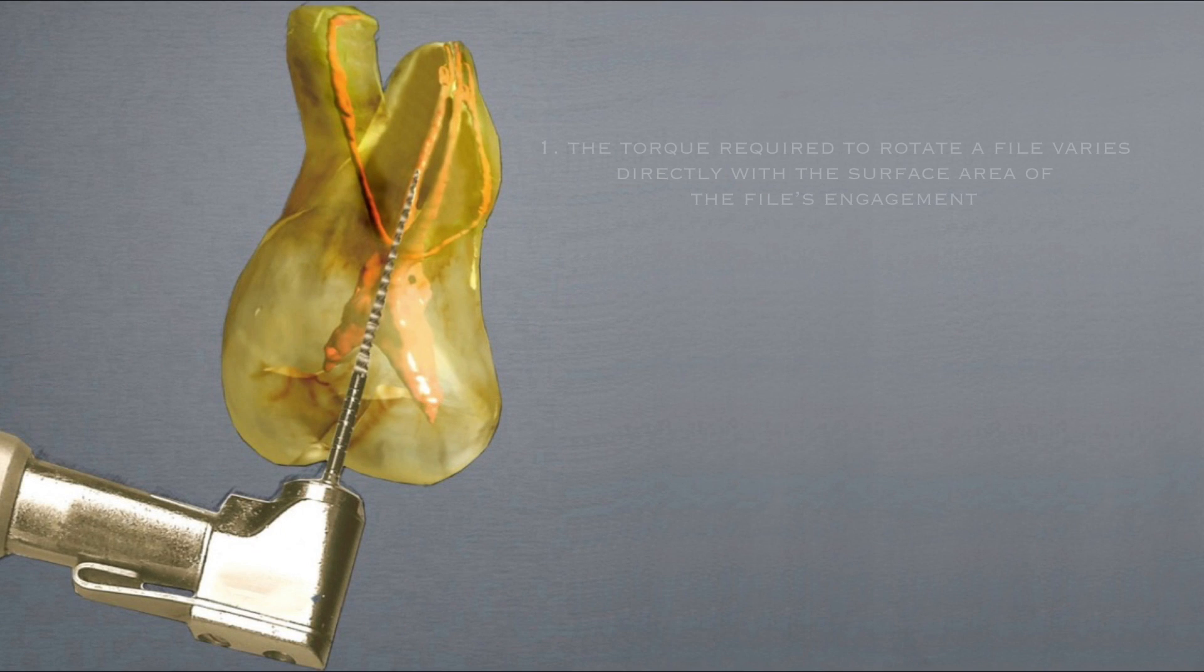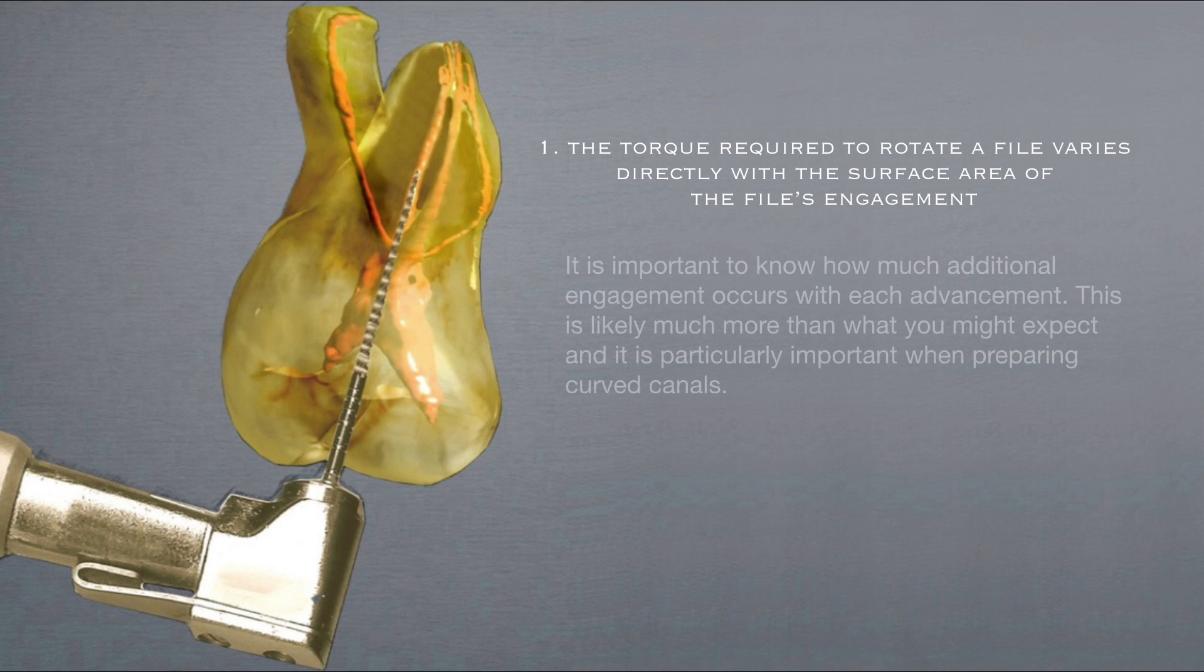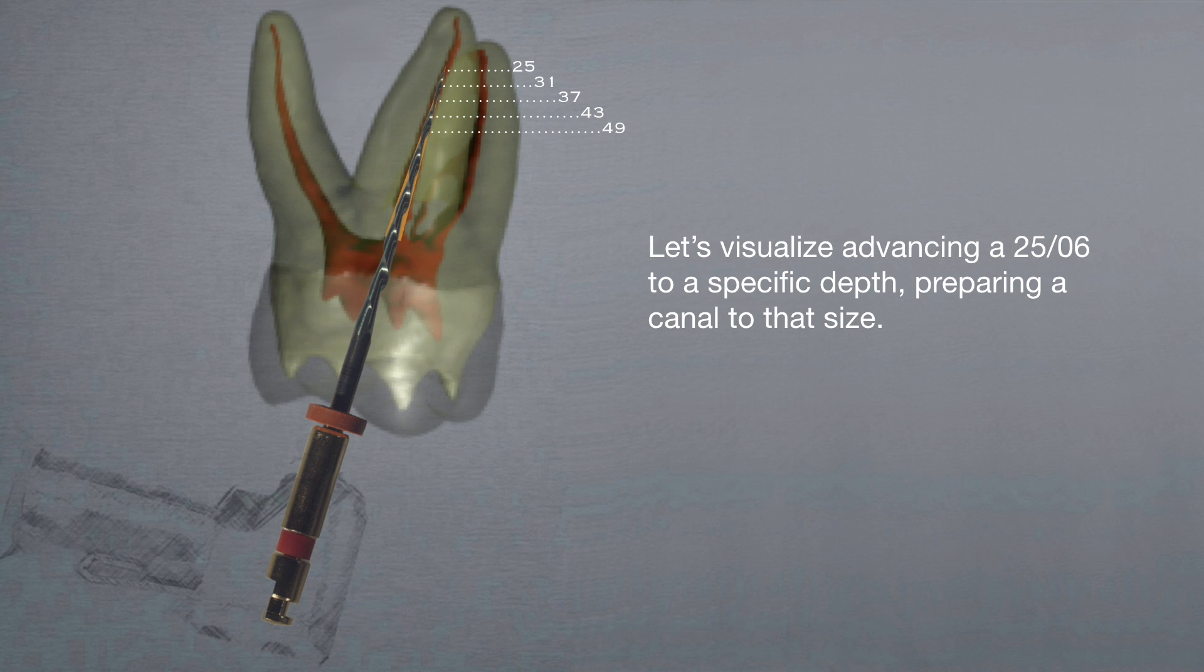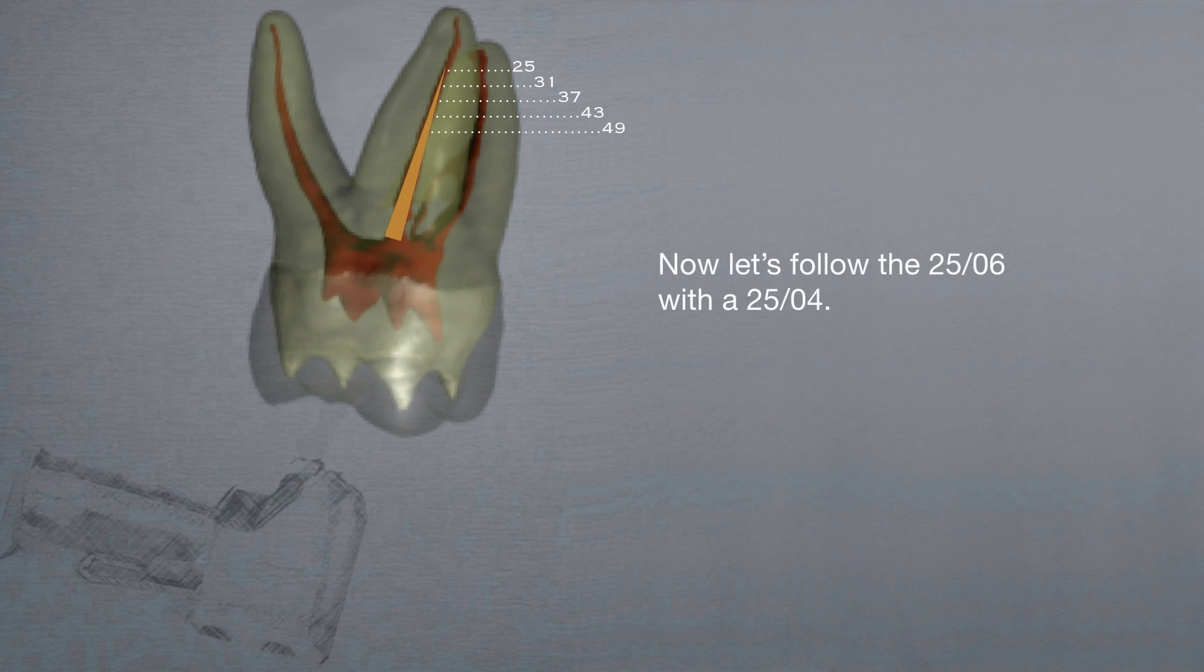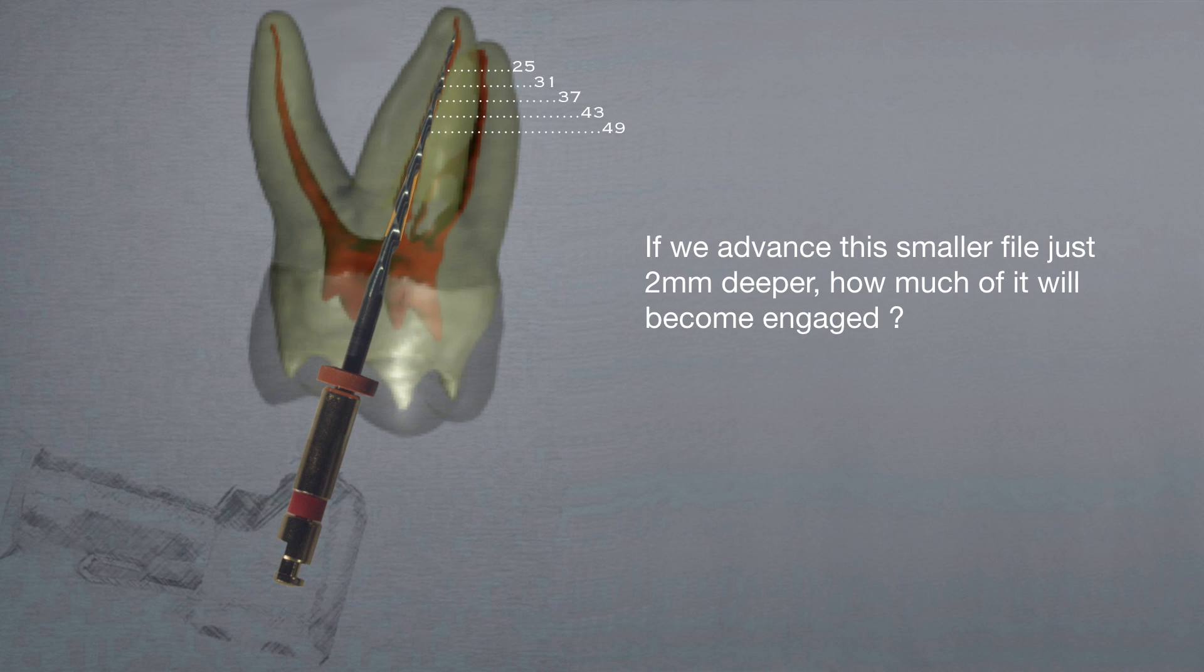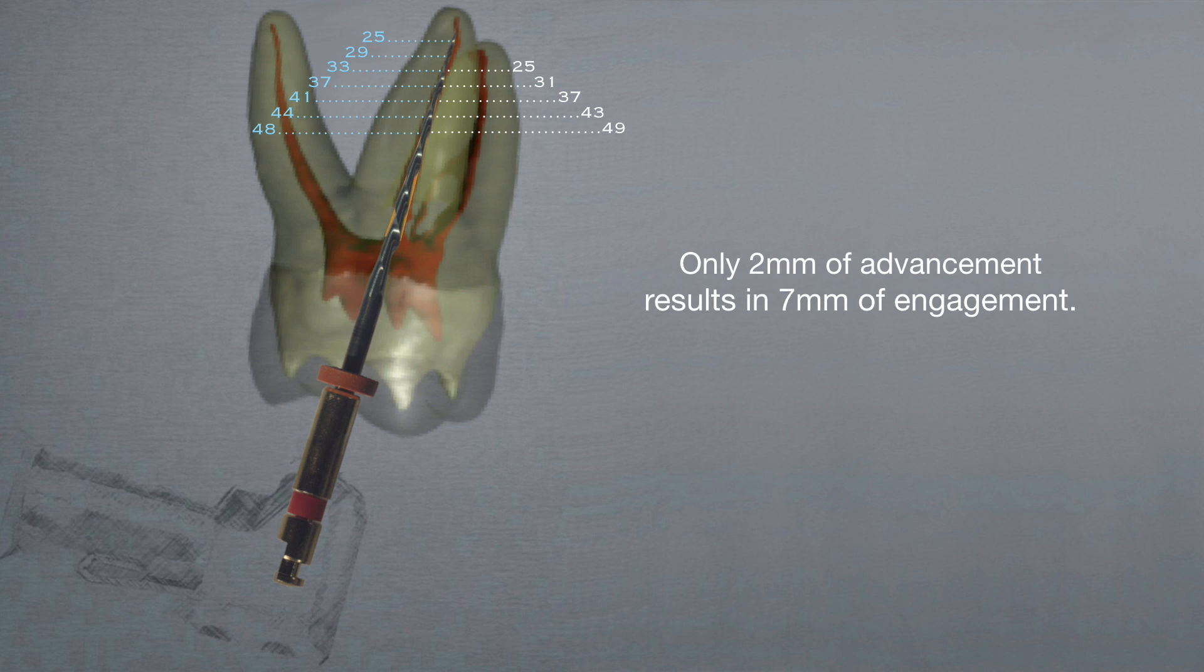Let's examine the first relationship. The torque required to rotate a file varies directly with the surface area of the file's engagement. It's important to know how much additional engagement occurs with each advancement. This is likely much more than what you might expect, and it's particularly important when preparing curved canals. Let's visualize advancing a 2506 to a specific depth, preparing a canal to that size. Now let's follow the 2506 with a 2504. If we advance this smaller file just 2mm deeper, how much of it will become engaged? Only 2mm of advancement results in 7mm of engagement.